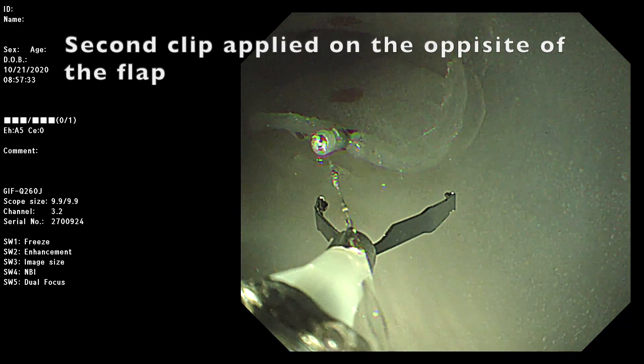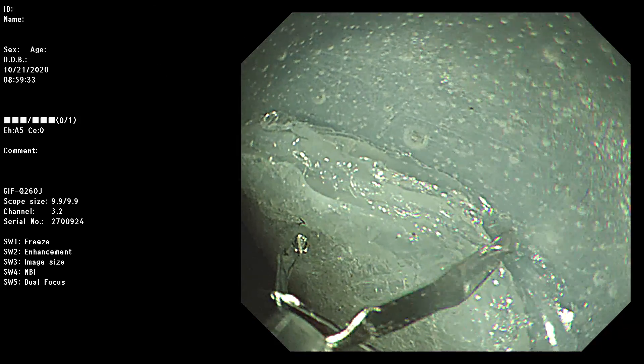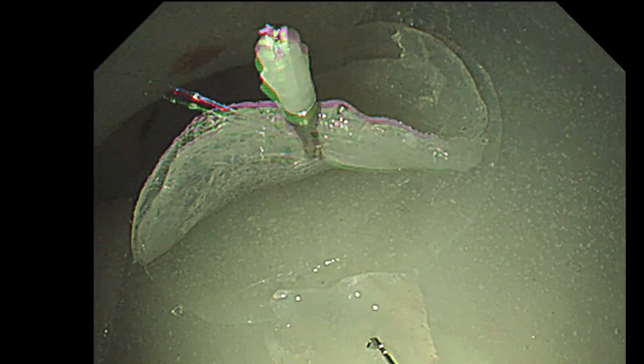The second clip was introduced and hooked the thread. Then the clip was applied on the opposite side of the model wall to form a pulley, controlling the direction of traction.